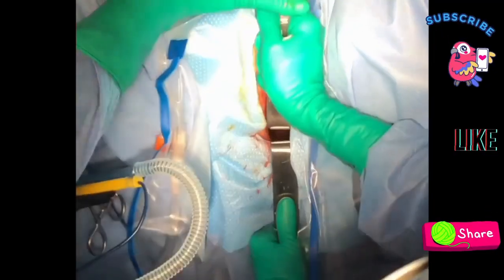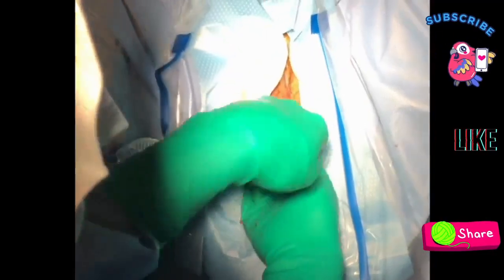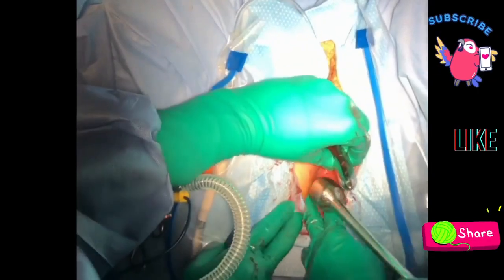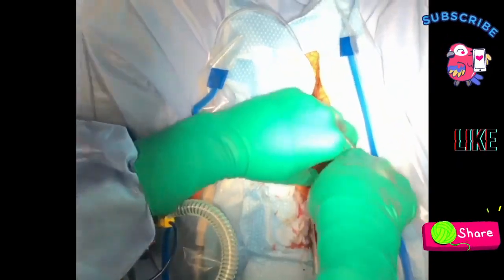Blunt dissection is continued with right angle retractors and then a large diameter Hagar dilator. Laparoscopic guidance is used throughout. A rectal probe can be used to deflect the rectum posteriorly to help avoid injury.